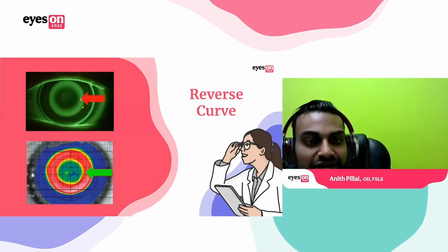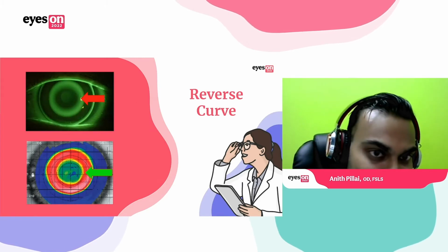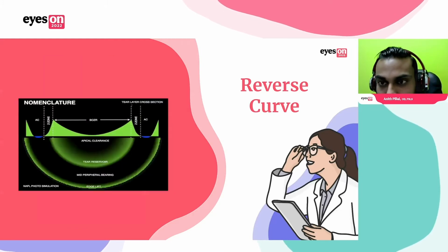The next curve is the reverse curve. On the top image, the fluorescein image, you'll see the reverse curve as that area of pooling, and the red ring on the bottom image on the topographical representation.